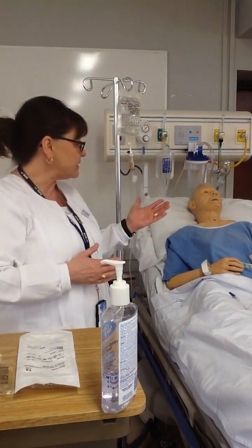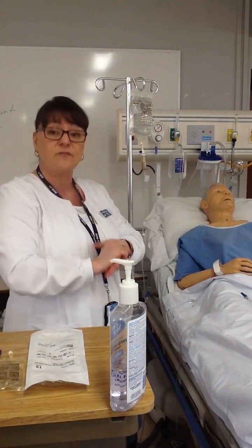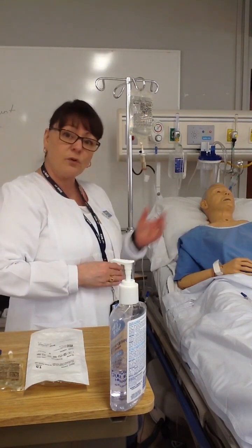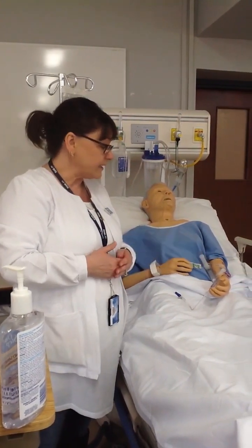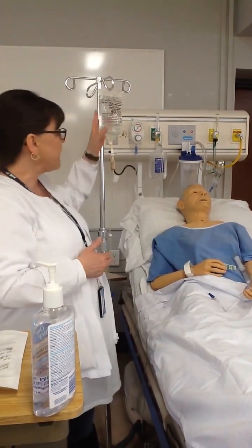I'm looking at Jesse's nonverbal cues to help me understand and assess if Jesse's okay with this or if he's afraid or concerned. While I'm here, I want to check the patency of the IV. So according to agency policy, we're flushing. Perhaps it's every 8 hours we're flushing and checking patency of an existing IV site, or if maybe we have a continuous IV solution running at a certain rate per hour, then we're checking that in our solution.